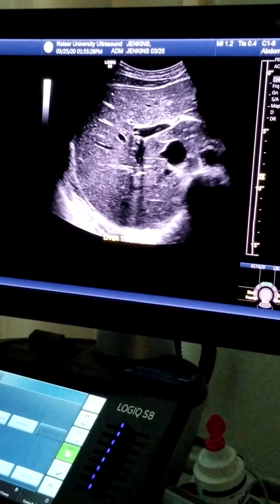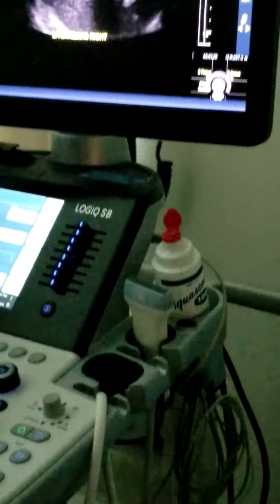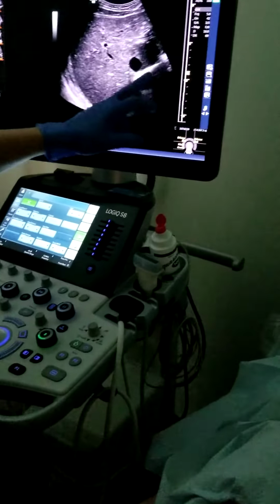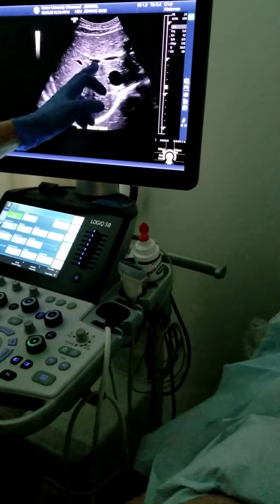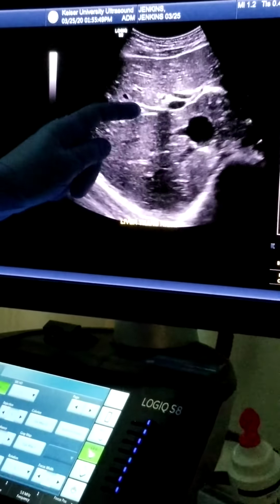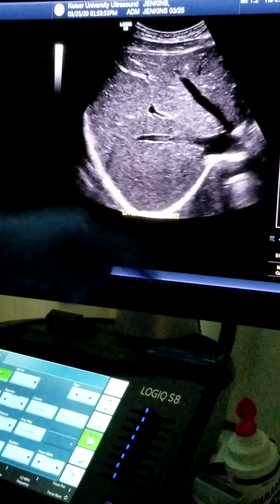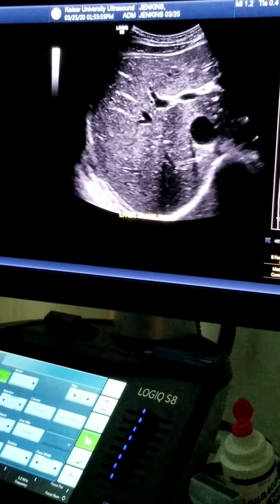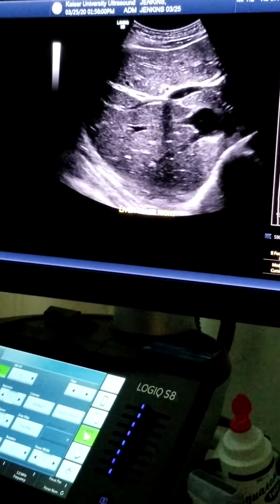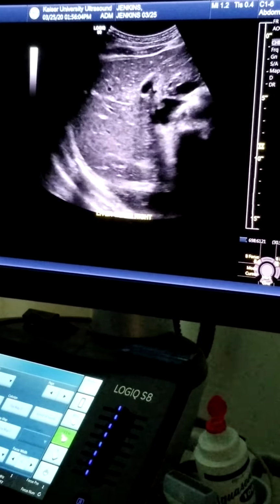So it's in my right lobe with portal vein picture. I'm going to go live again. When you're ready, take a breath in, please. I'm not going to take a picture here. I just want to show you all. So this is her main portal vein coming into the right portal vein. And then you can see here it's going to branch into the anterior right and the posterior right here. So here's the anterior, and here's the posterior.